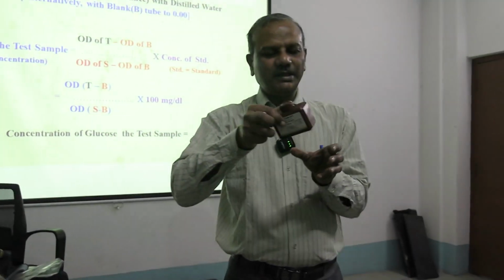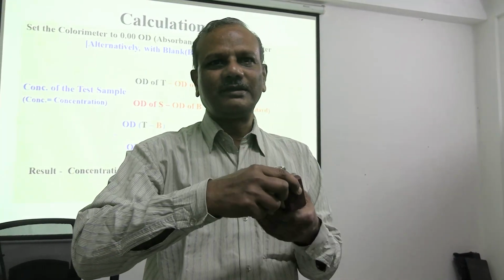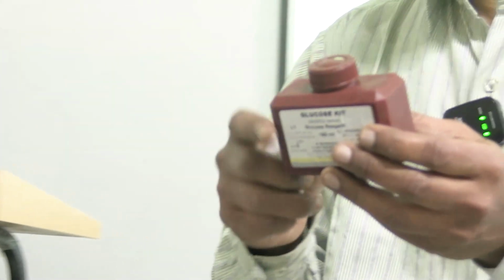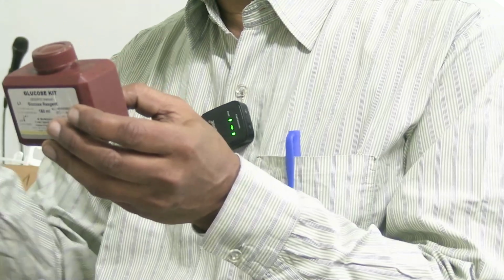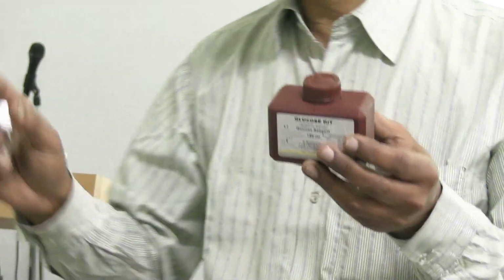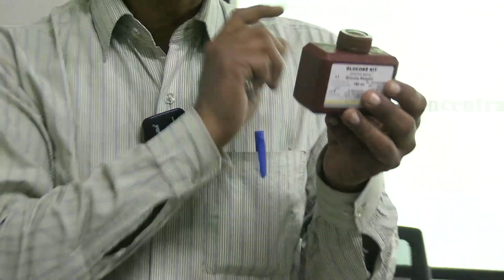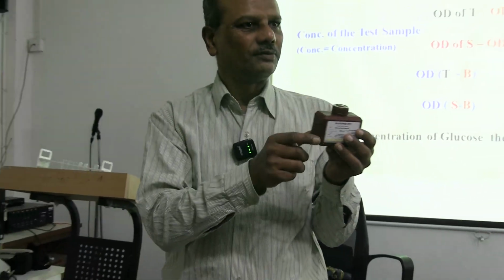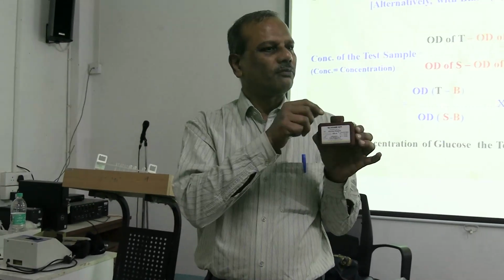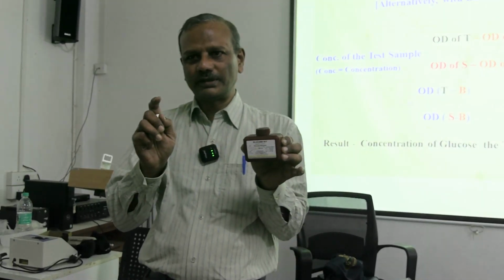Always make it a point that you shake it a little, because there might be some sediment. This is a heterogeneous material, not a pure solution. Suppose you take glucose, it will be in true solution. If you take sodium chloride, it will be in true solution. But this is a colloidal solution, so it is better to shake it. One thing will happen, some frothing will be there. You avoid that frothing.